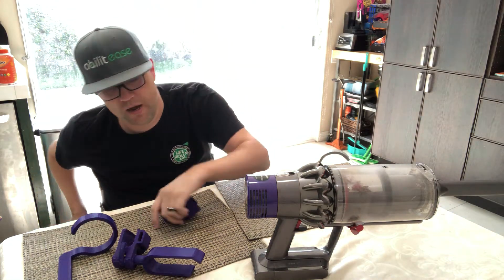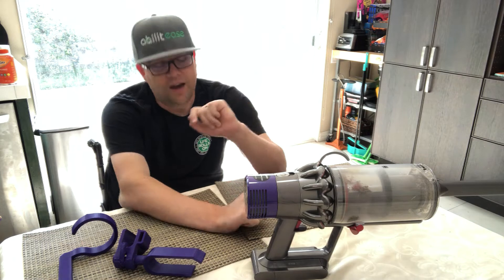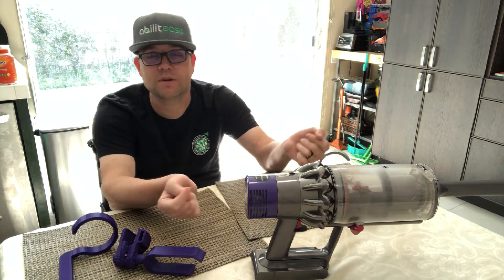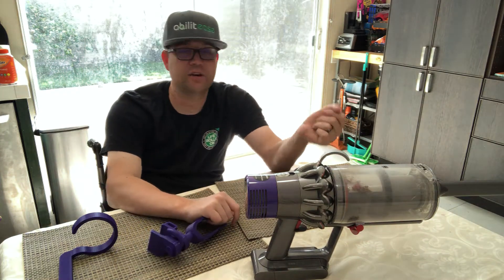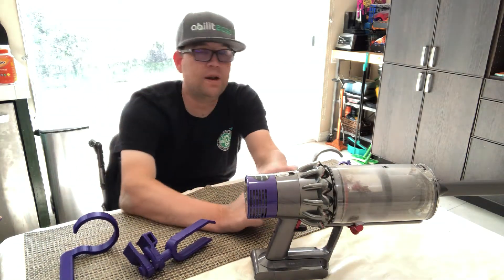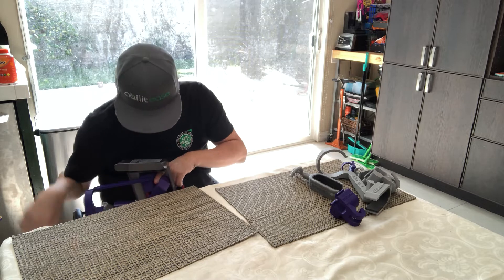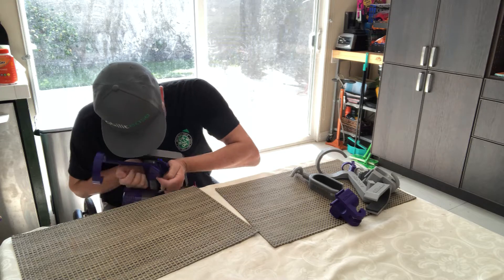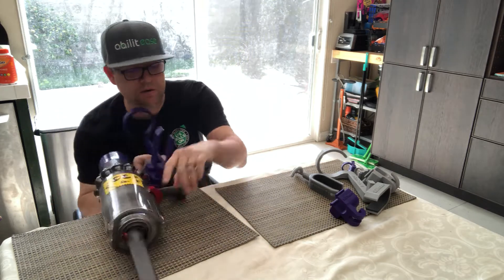Version 1 was really designed for the handheld attachment. I said let's start small, because with the large attachment you need something more robust. So I started with the handheld to see how it worked. I'm going to attach this to the unit now — turn the unit to get leverage and push this in just like that.